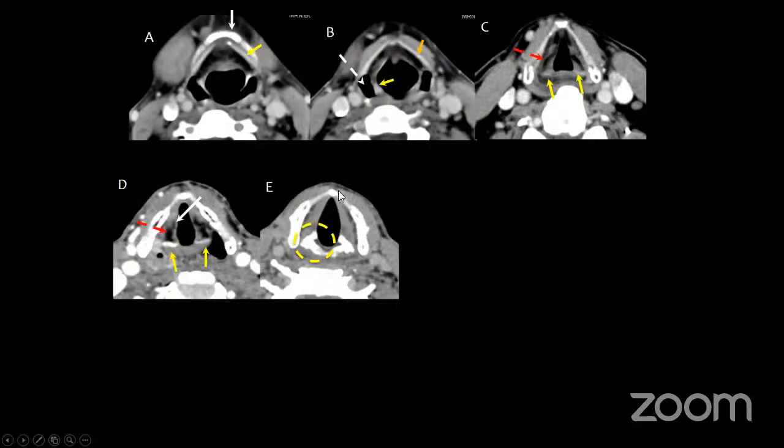So when the anterior commissure hosts the insertion, there is deficiency of the perichondrium in this region, and it is the attachment of the Broyles ligament at this space. Why it is important is that disease of the anterior commissure has a high propensity of thyroid cartilage invasion because of this deficient perichondrium in this area.